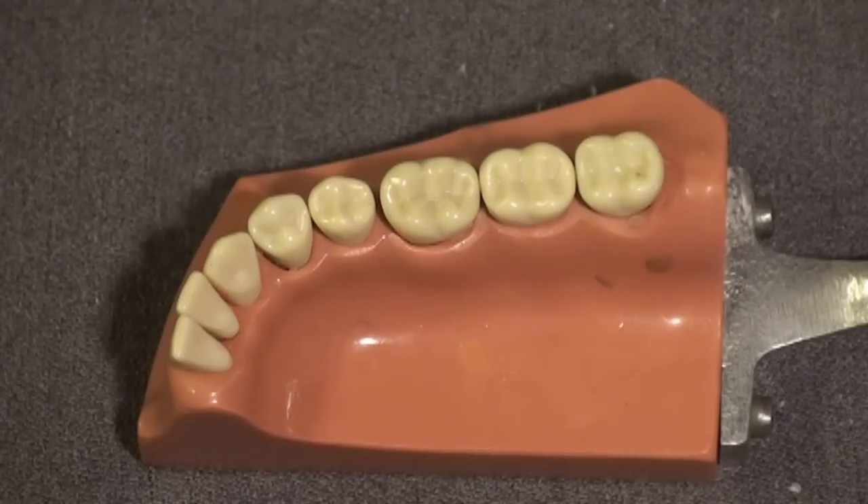We're going to place a class 2 light cured composite on tooth number 31, using a clear custom matrix technique that will save the dentist and the patient five to ten minutes of chair time on every composite that they place.